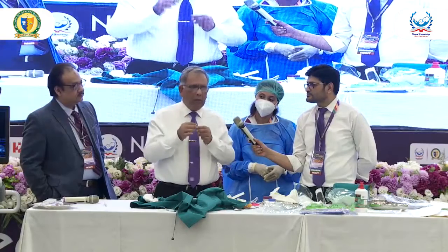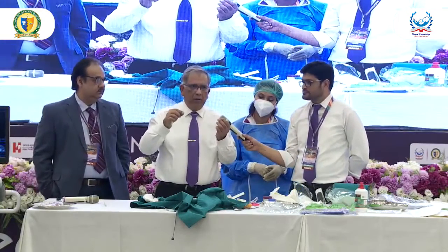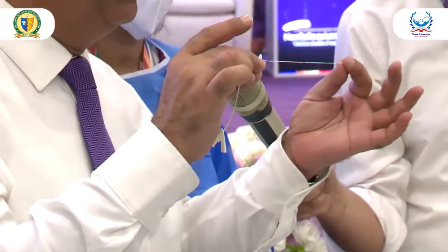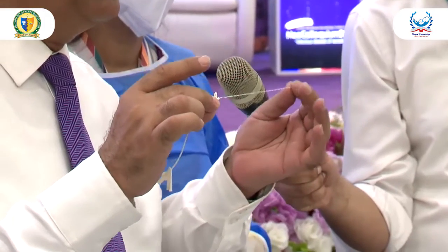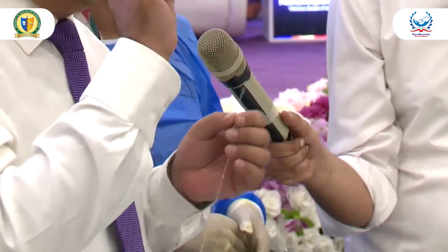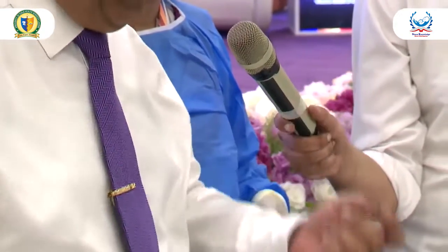So if I think the polyurethane, they recommend that you can cut it. So if this is 20 centimeter, how much would you cut to make it, let's say 14 centimeter? कितना काटेंगे? 20 में से 6 काटेंगे. So 6 काट के front के ऊपर से आपने notes में you have to mention it in the notes that you have cut 6 centimeter, and then you can thread it.